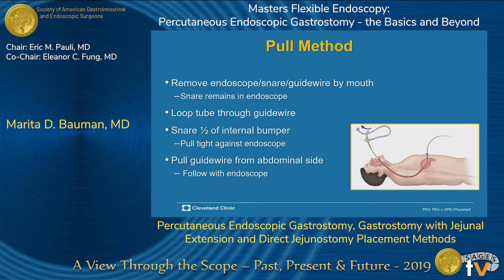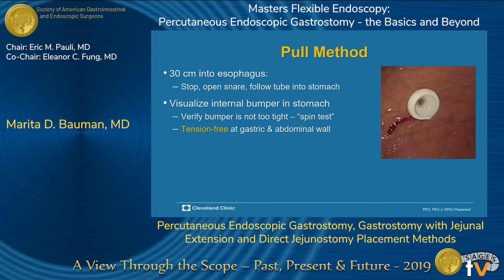Now you have the guide wire entering the patient's abdomen and coming out of the patient's mouth. At this point, loop your tube through the guide wire. I like to snare just half of the internal bumper with the snare, close the snare, and pull it into my working channel such that the bumper is flush with the endoscope. The assistant at the abdomen is then pulling that guide wire and you're forced to follow the PEG through the mouth into the esophagus. When we get about 30 centimeters into the esophagus, we stop. I let go of that internal bumper with my snare and pull the tube into the stomach. Most importantly, follow the tube into the stomach and actually visualize that the internal bumper is in the stomach. Make sure it's not too tight against the gastric mucosa — when you spin the tube externally, you should be able to spin it without pulling gastric mucosa with it, and it should be tension-free at both the gastric and the abdominal wall.